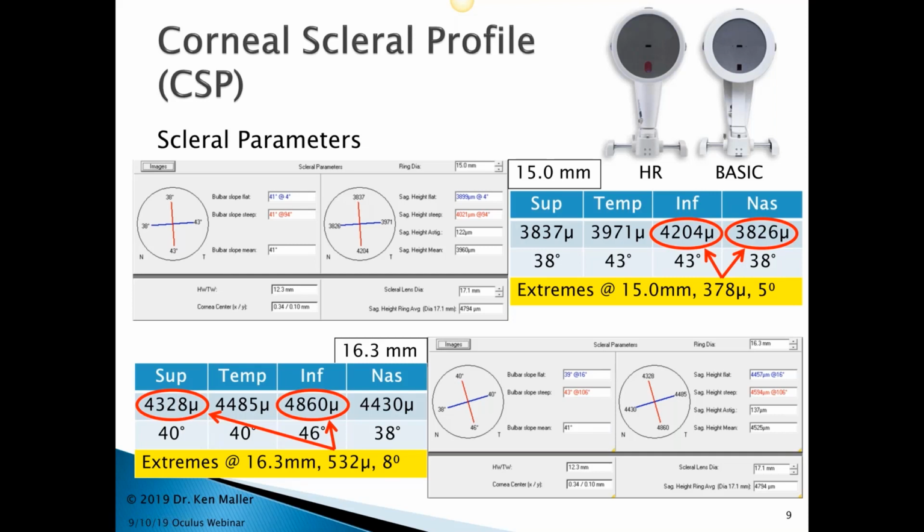So it plays very well with wave, and I've really enjoyed the interaction of the two technologies, but don't feel for a second that you have to use wave with the CSP software.